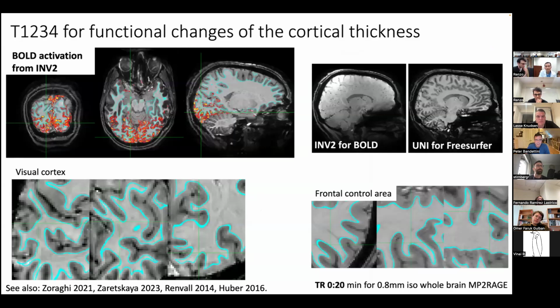Since the 3D EPI acquisition is as fast as getting a whole brain volume in 20 seconds, this allows us to do all kinds of fun readout gymnastics. Namely, we are approaching the time scales of typical fMRI block durations. So we could do a functional activation right during the structural acquisition, just alternating a checkerboard block across different averages.